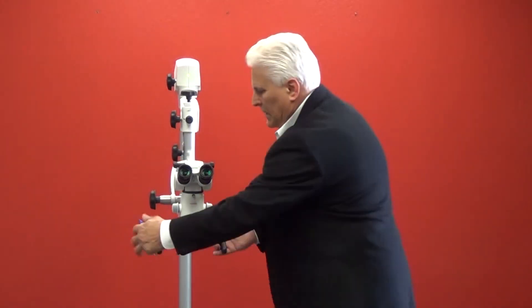Now for the demonstration. Set all the tension knobs to minimum contact so that there is minimal resistance with no drift, giving you a more free-flowing movement, as demonstrated.